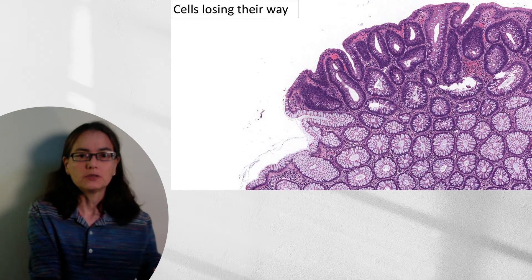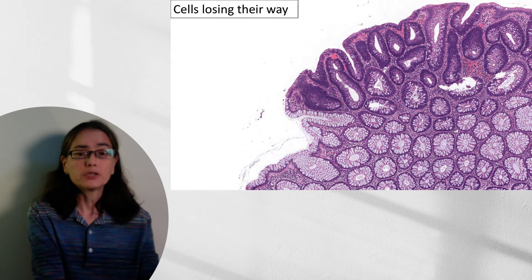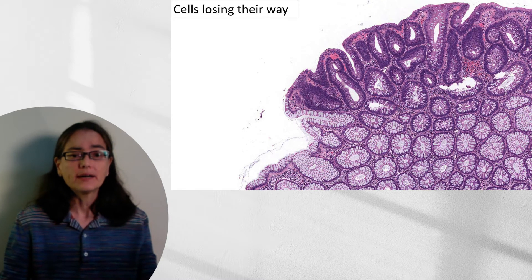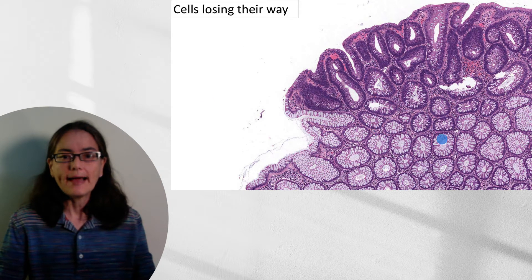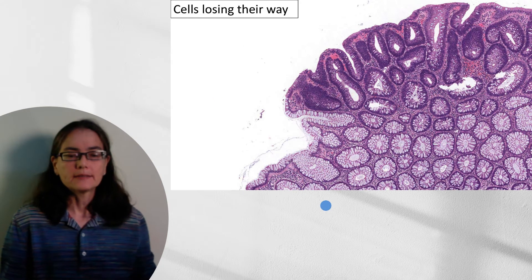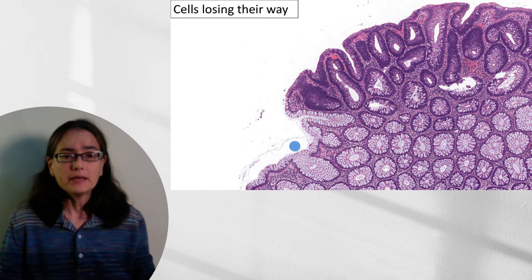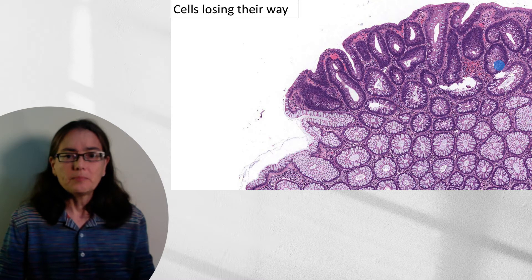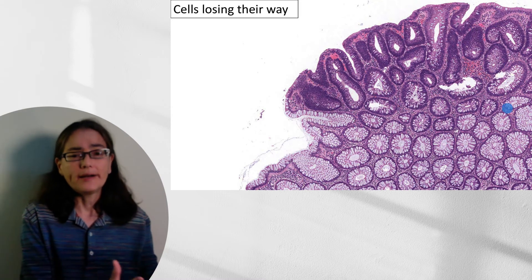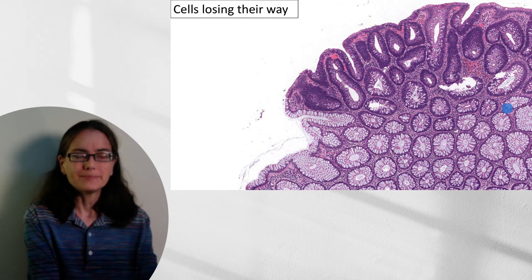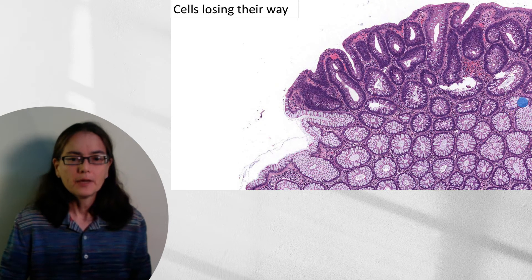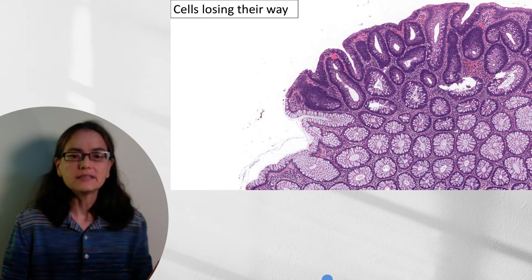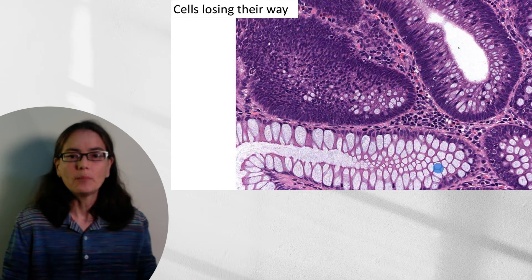Let's look at cells losing their way. This is a beautiful image of a tubular adenoma. It very nicely shows normal, happy mucosa here. This is very happy colonic mucosa — it wakes up in the morning and says, I'm going to make mucin. These dysplastic cells, on the other hand, don't wake up thinking that. They're still making a little mucin, but not so much.